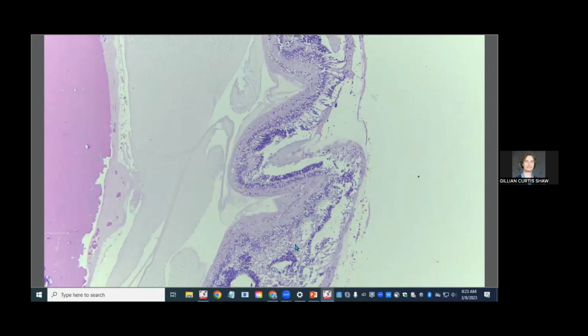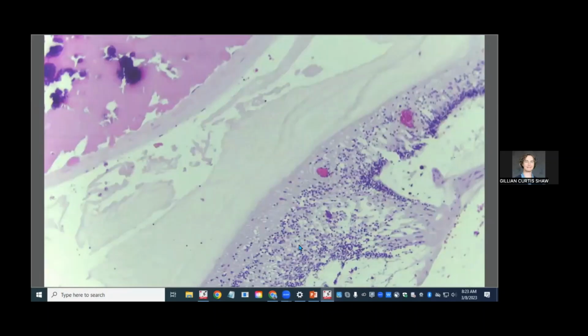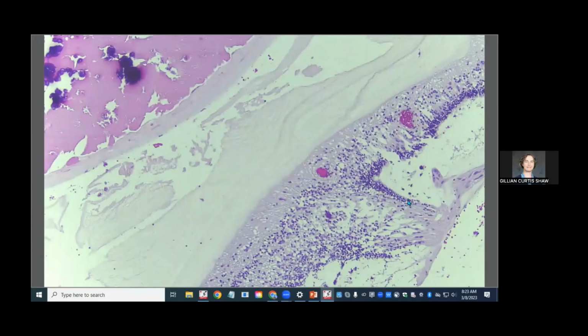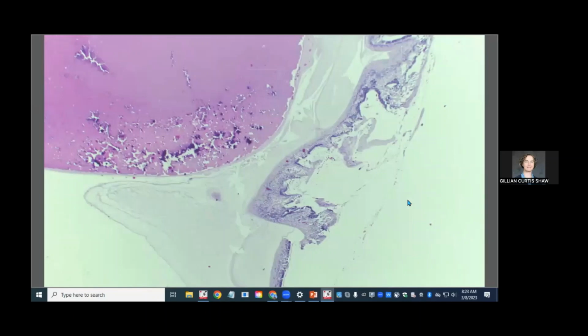And then remember, I told you to always check the retina for blood vessels to more fully diagnose a congenitally abnormal retina. But you can see we've got some nice blood vessels here. So this retina did have a connection to the optic nerve, if you didn't have the benefit of being able to see the gross photo or good gross notes. Okay, so that's all I can show you for this cool eye.